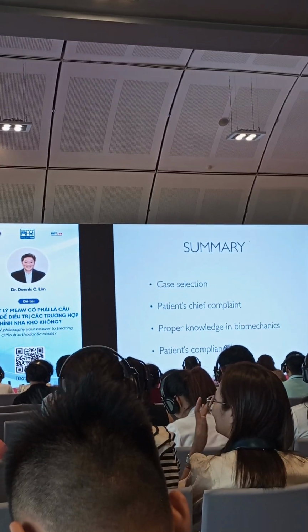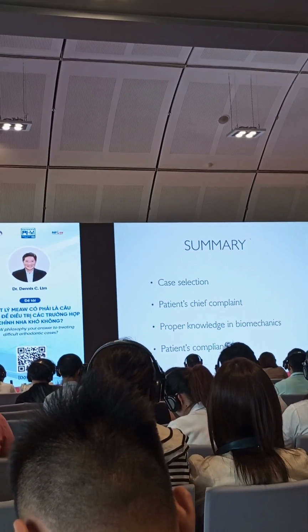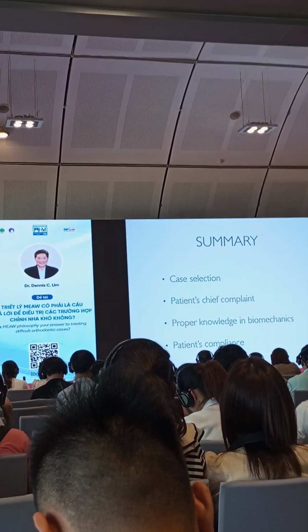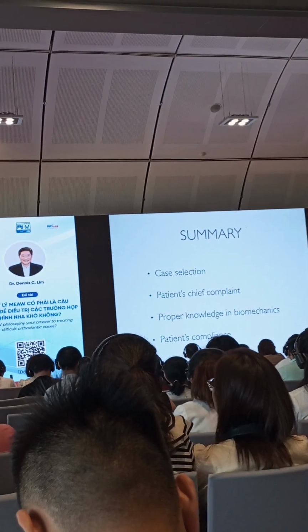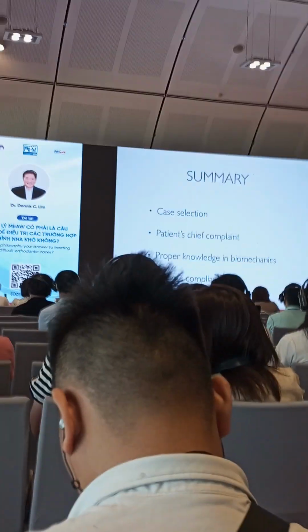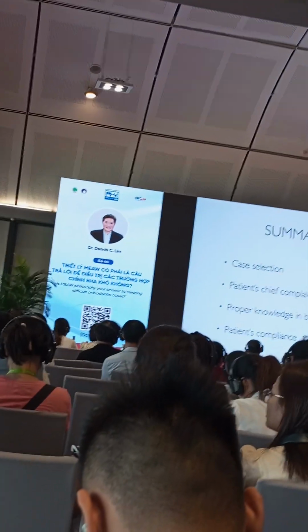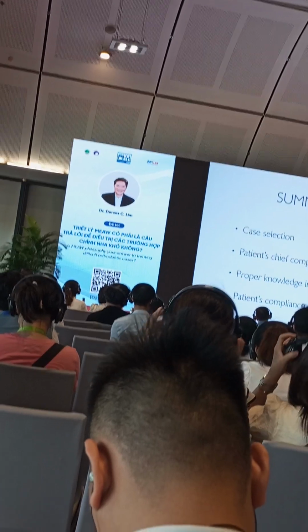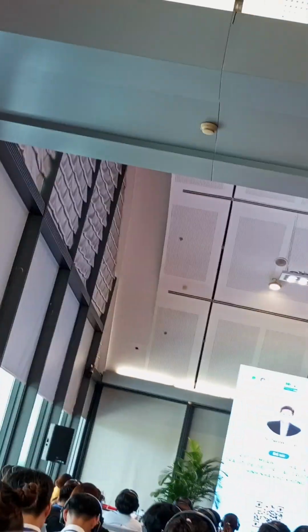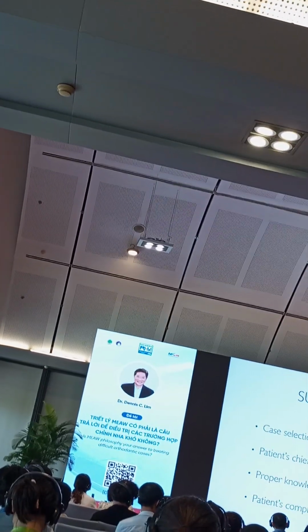And then patient compliance. You need the cooperation of the patient, especially if you are asking the patient to use the multi-loop arch wire. If the patient doesn't wear the elastics, then that particular mechanics, no matter how good it is, will not correct. Just like what you saw on the second to the last case of the open bite, wherein the open bite didn't close because the patient compliance was very poor. So I needed the help of other accessory materials to be able to correct that particular malocclusion.